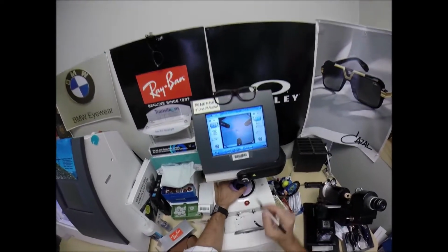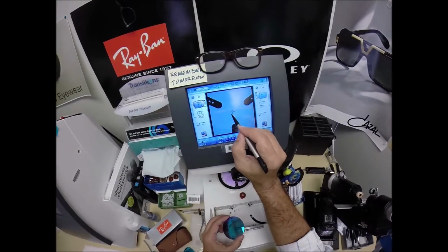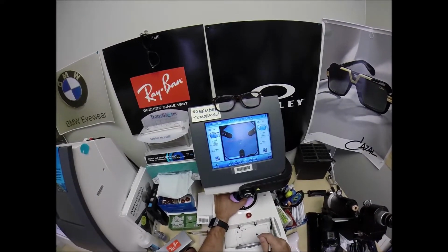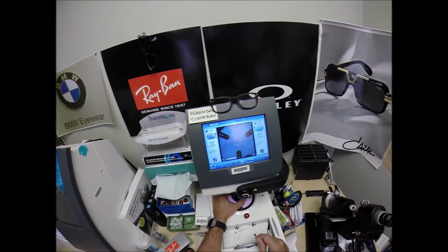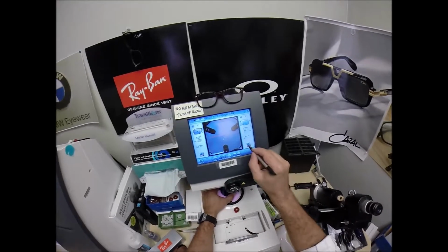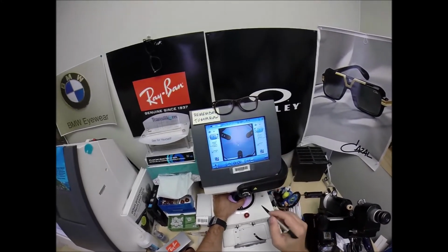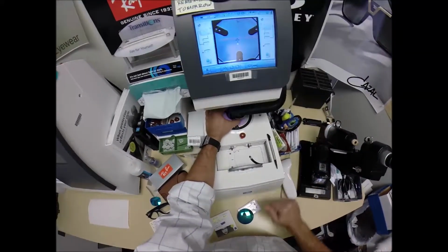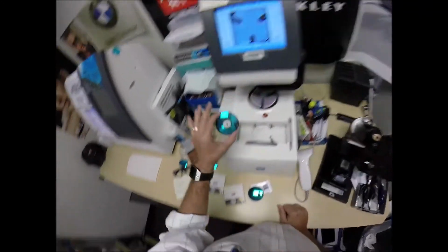get everything lined up in there just perfect. That blue cross is the geometric center of your frame. Your eye is just above that, in inset. So I'm going to get those three dots into the orange crosshair to make sure everything is perfect. Do that there. Hit that button, the arm's going to come down, place the block onto the right lens.